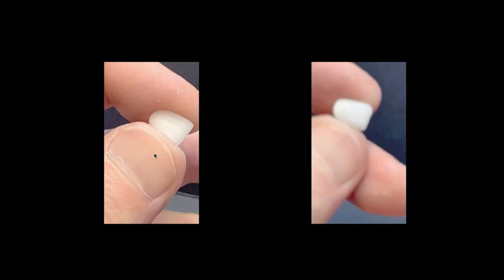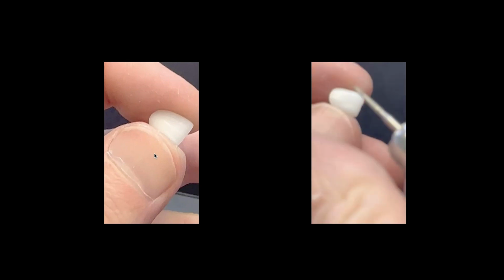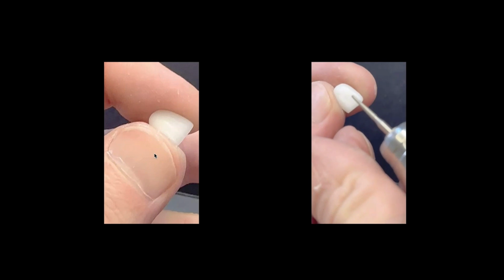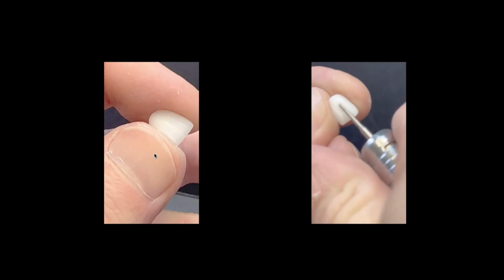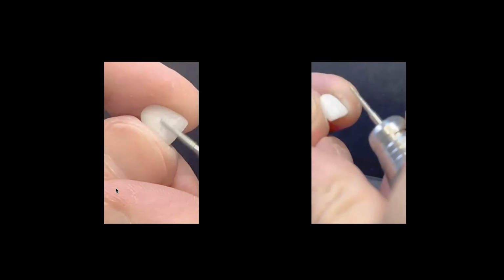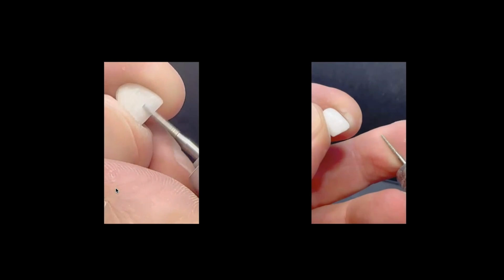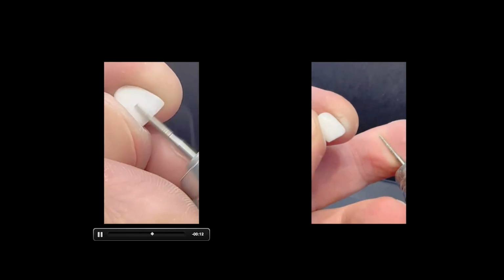So I made a few quick videos of trying to create some surface texture and topography. And I think it's kind of difficult, right? This is one of those things that's best done sitting down close up with people and really working through it. But I did it basically just to give you the understanding that it's never exactly one thing. Sometimes I'm using a flatter edge burr and working my way through the whole tooth. Sometimes I'm picking and choosing little areas that I want to roughen up. And each of those is critical for me to get to where I want to go. So let's go to the next group here.